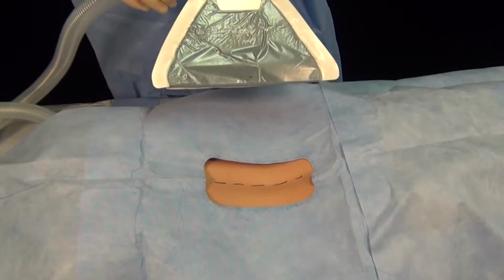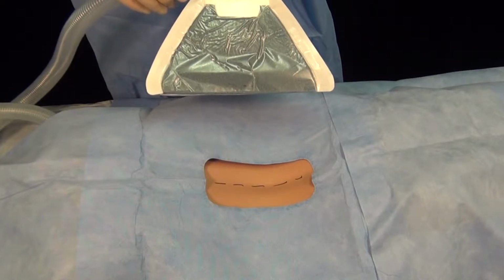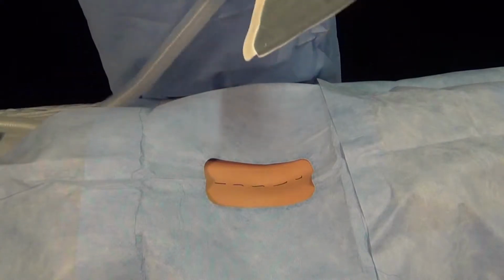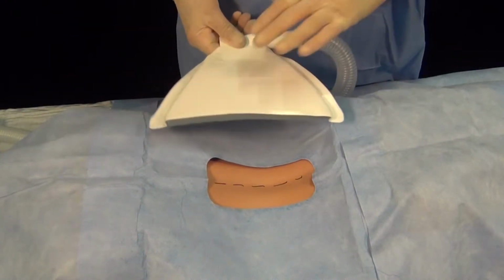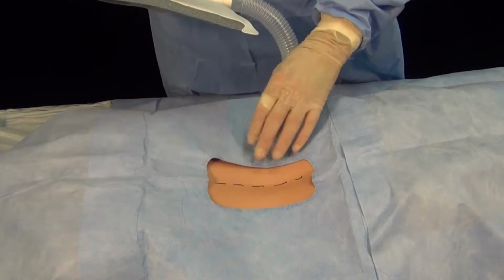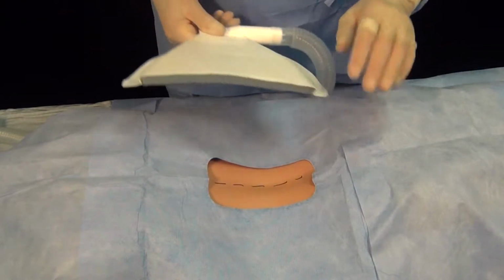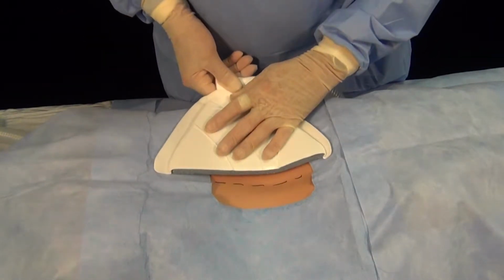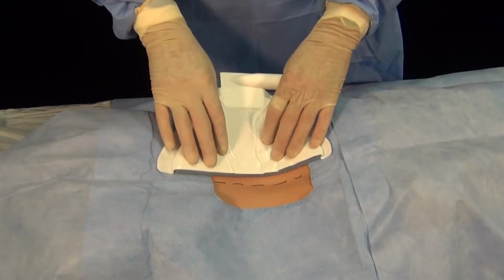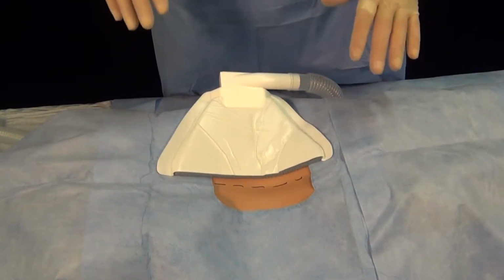The next incision is the midline back incision for posterior cervical fusion or decompressions. And here again, the same principle. It doesn't matter whether you put it on top of the outer surgical drape, the clear surgical barrier drape, or the prepped but dried skin. The principle remains the same, and that is to put it as close to the line of incision as possible. You can see that the flexibility of the device allows it to remain adherent.